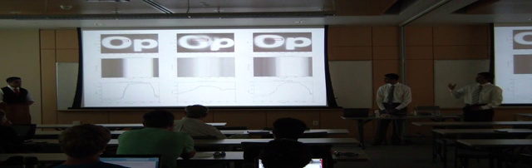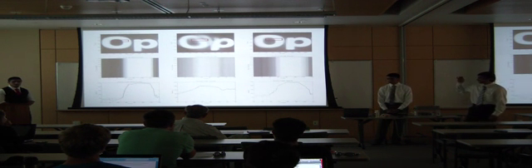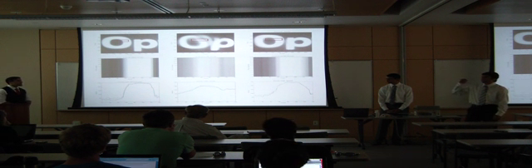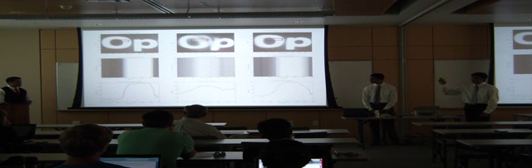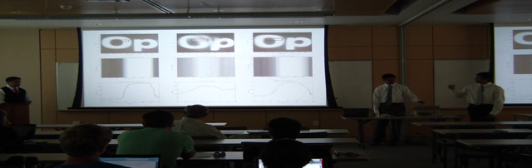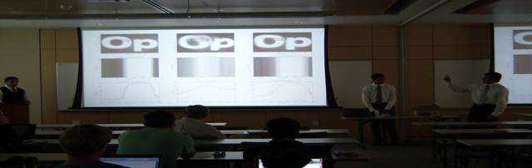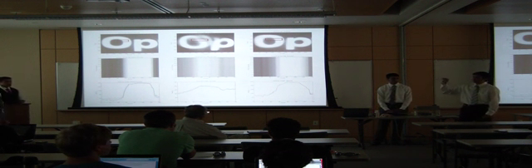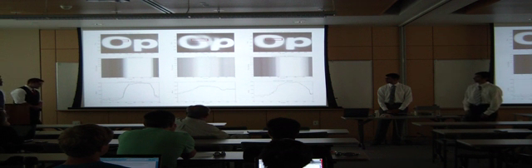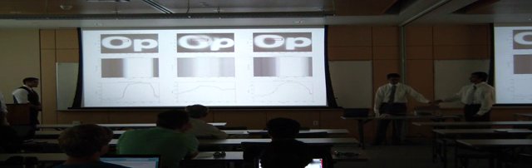Next, what we did is we wanted to quantify how effective our Helios jet is. So we took an image with our endoscope, but with the non-PEG lens. The first column shows before we smudged it. The second column is when we smudged it, and the third column is after we washed it. The red boxes indicate where we looked, and we wanted to show the difference between the intensity levels in the black and white sections. And Parag's going to go over the data.